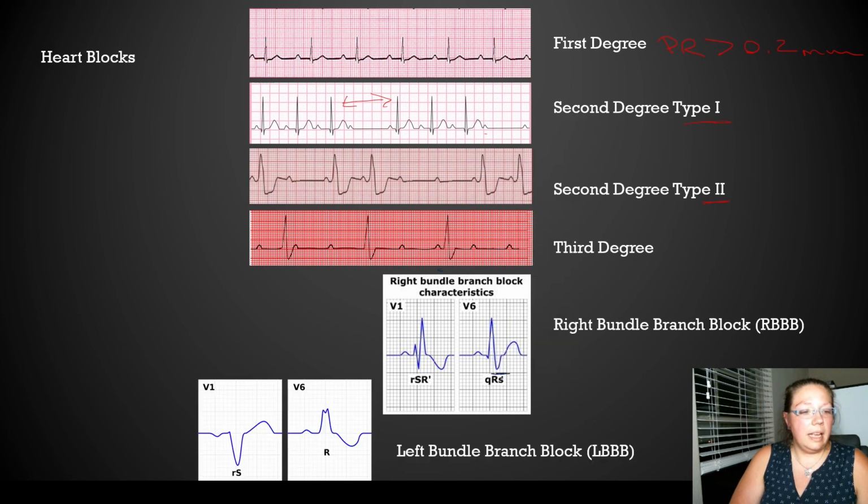Your S is wide, like the QR. Wide S. So RSR, QRS, long S.